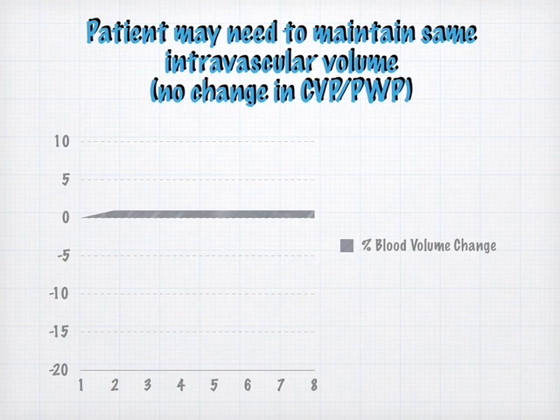I just wanted to remove fluid at the same rate that the patient was mobilizing it from their third spaced areas. So if I removed 500 cc's of fluid an hour and they recruited 500 cc's an hour, then by the end of a 4-hour run, I've removed 2 liters, but I did not change their wedge and I did not change their CVP.